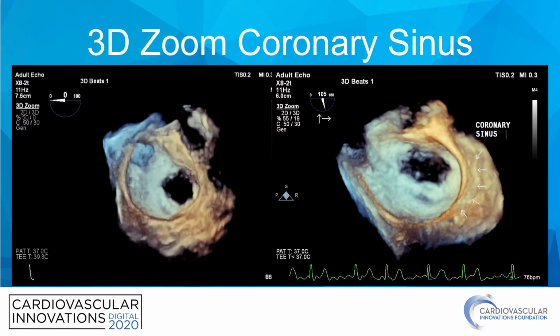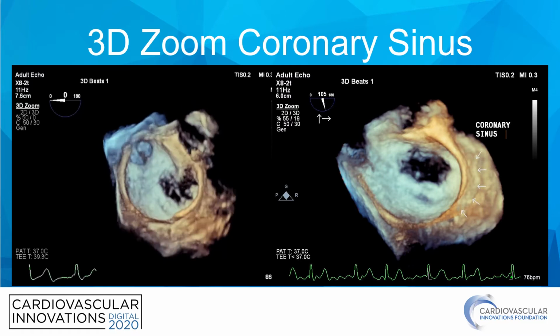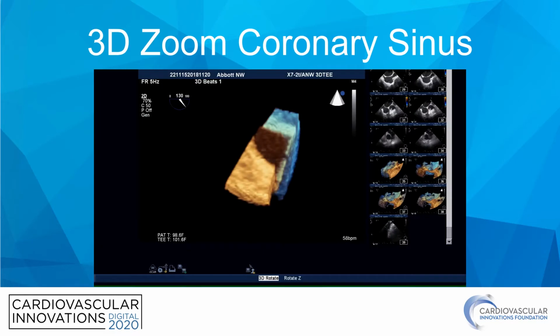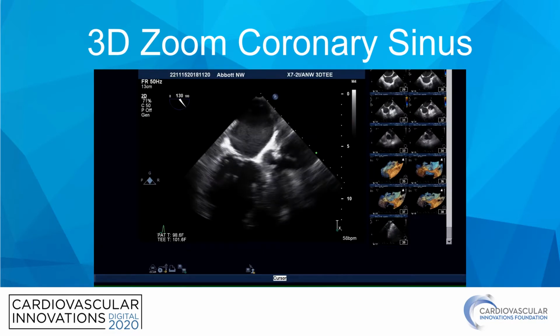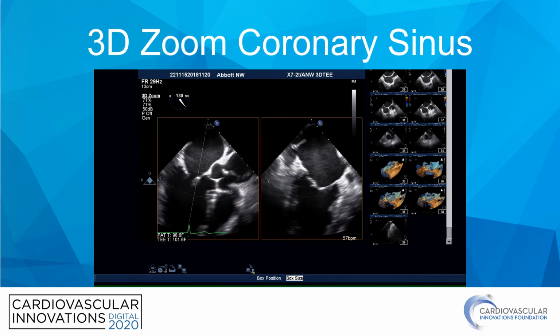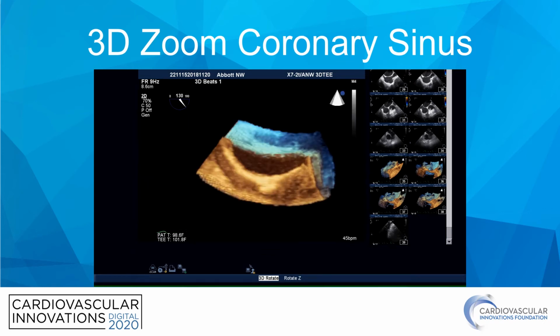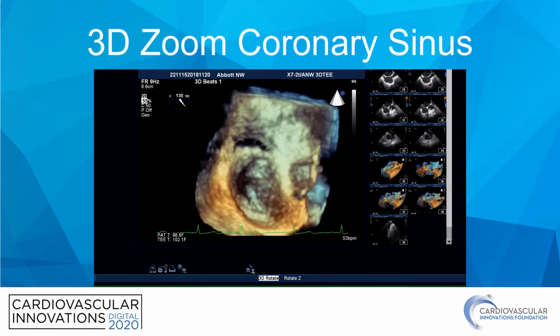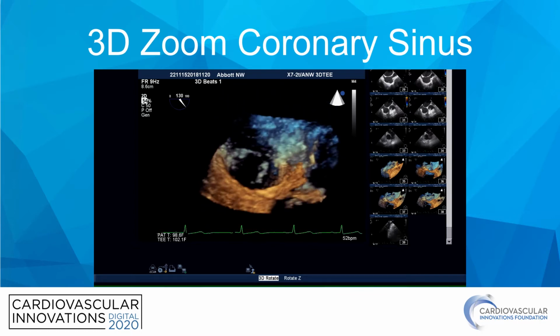With careful placement of the 3D zoom box, the proximal coronary sinus can be visualized. Here you can see how the 3D zoom box is adjusted to cut into the coronary sinus. The 3D image can then be manipulated to demonstrate the proximal coronary sinus.